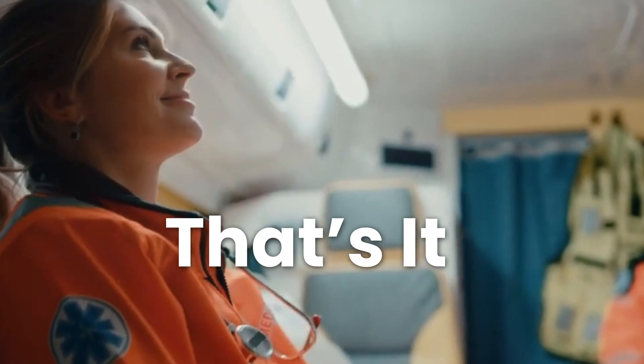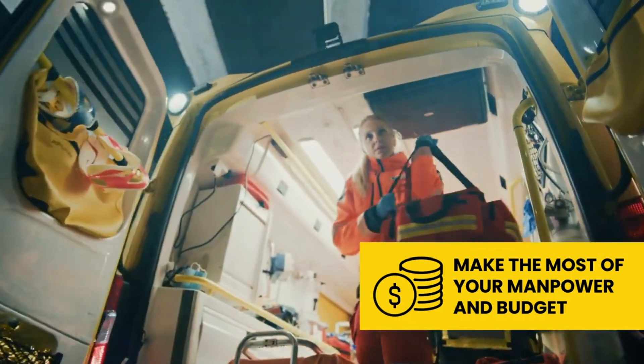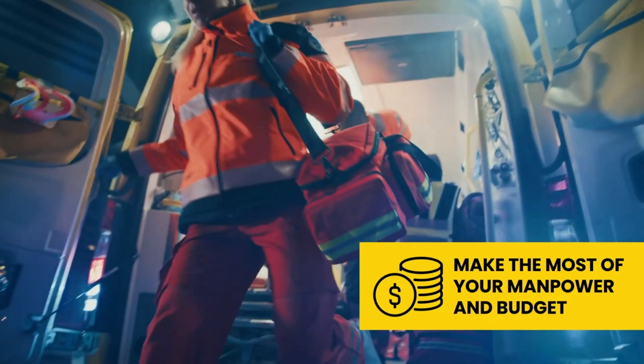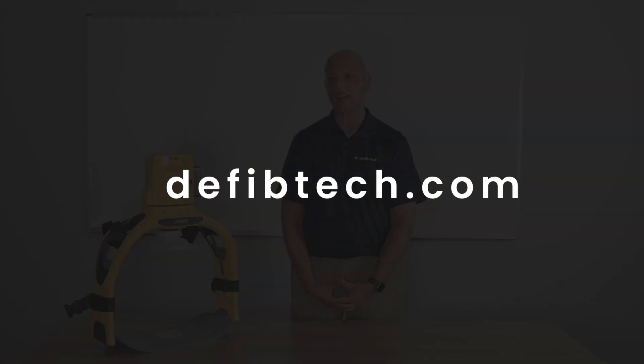That's it! The ArmXR device can help first responders save time and resources when running cardiac arrest codes. The simple application and use of the ArmXR can help crews operate with smaller teams, making the most of their manpower and budget. To learn more about the ArmXR, visit defibtech.com.